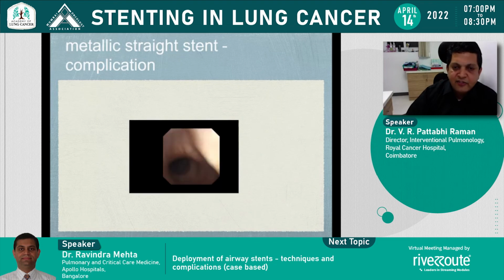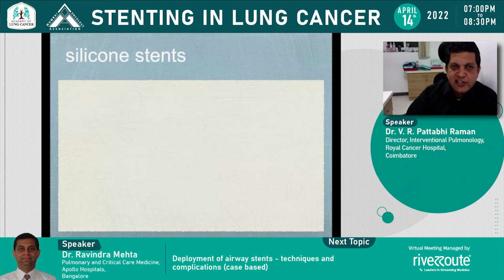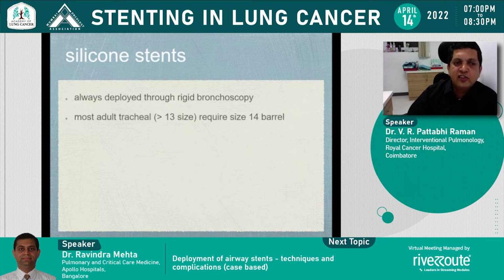Next slide. I think we've shown this again. We don't need to go through. And in silicone stents, next slide. It's either straight or Y. It's always deployed through rigid bronchoscopy. So for silicone stents, you'll need rigid bronchoscopy skills.